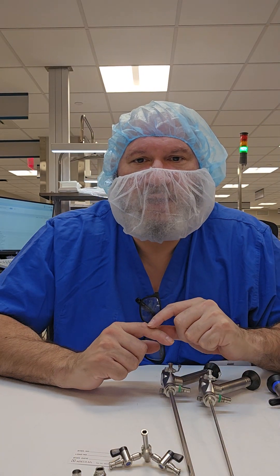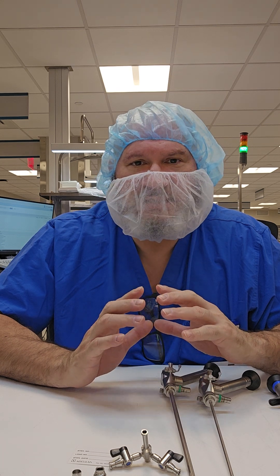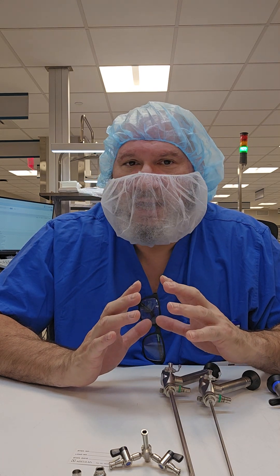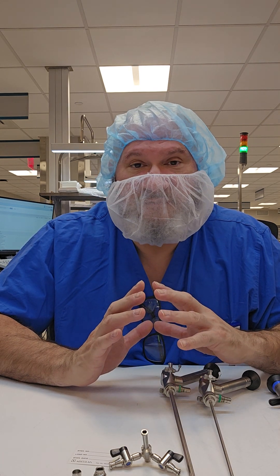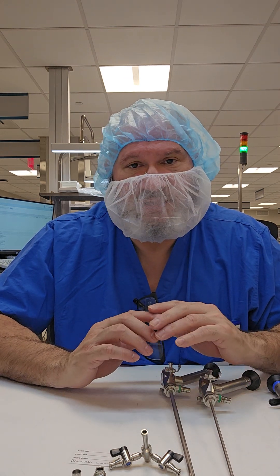Welcome back to WDYDCSP — What Do You Do as a Central Sterile Processor? Today we're going to continue with visual learning, and today we're going to learn about rigid and semi-rigid scopes.